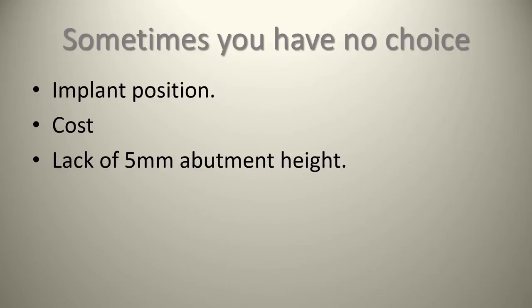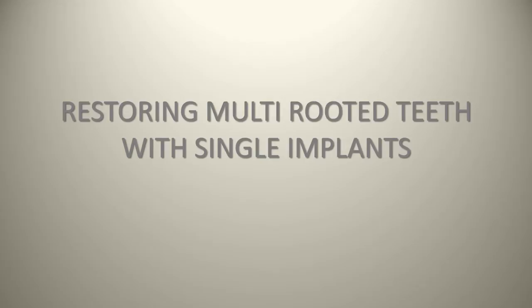So continuing along with our clinical pearls, we're going to talk about restoring multi-rooted teeth with single implants. This isn't a super complicated point, but it's a small pearl, in the sense that many times with implant dentistry, people think, okay, wow, these implants are awesome. They're more solid than the Rock of Gibraltar. Let's put in one implant in the upper cuspid position and another implant in the posterior second molar position, and we'll basically have a bridge connecting these.